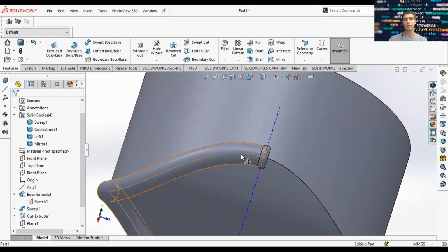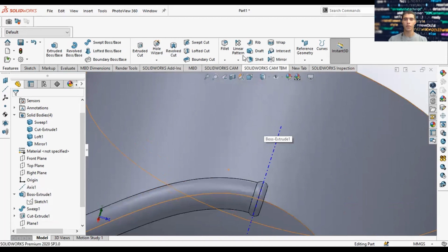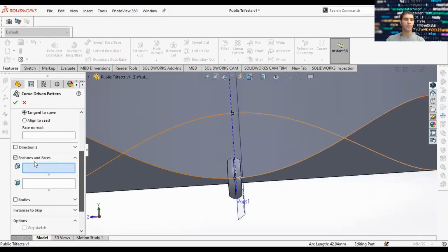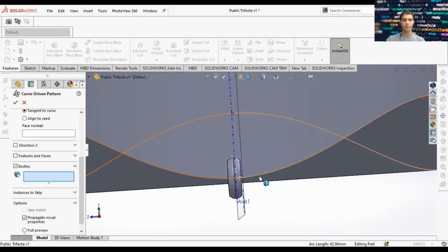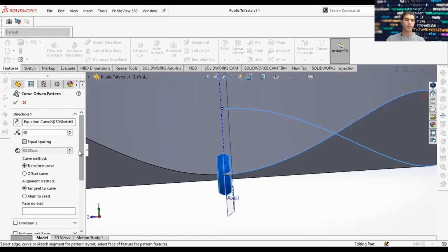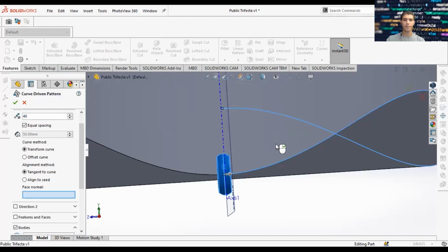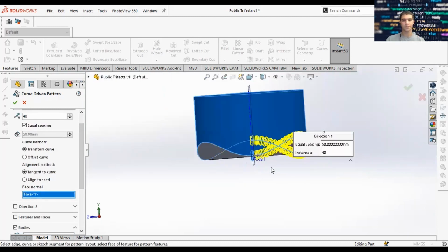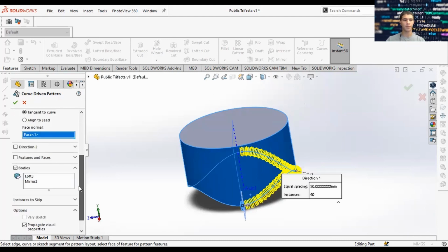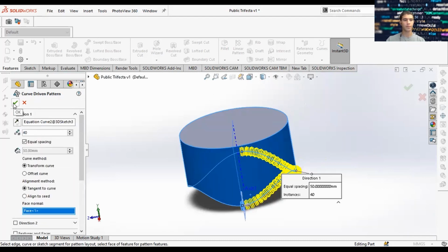part. So we're going to incorporate a feature called curve-driven pattern. There we go. That's better. So now we have 40 equally spaced instances of our mirrored body across the curve.